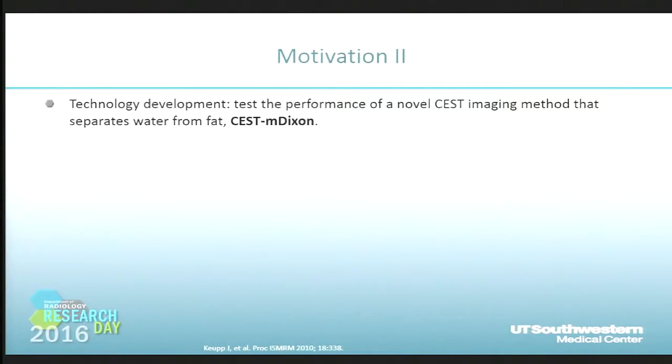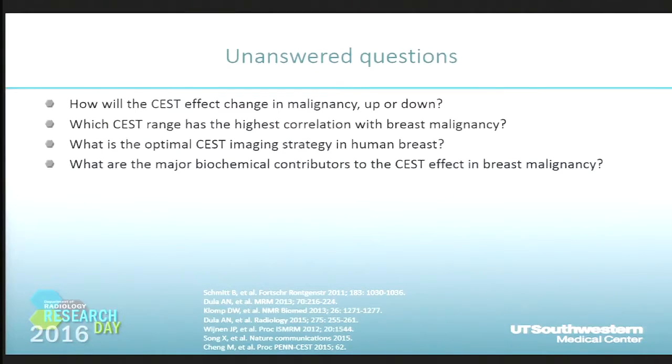Another motivation for us to apply CEST to breast imaging is from a technical development perspective. We would like to test the performance of a novel CEST imaging method that separates water from fat, the CEST mDixon method. I'll talk more about this method in later slides.